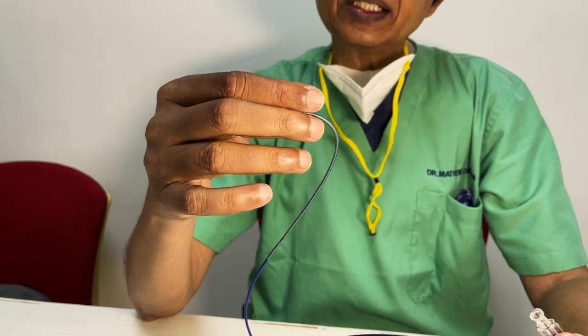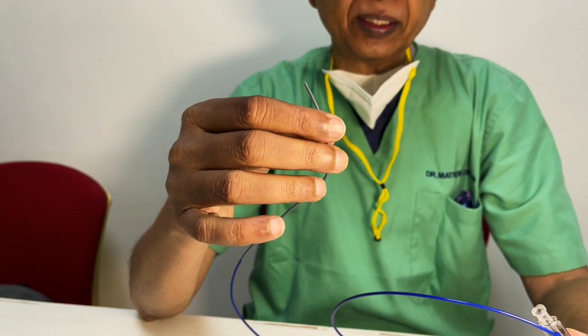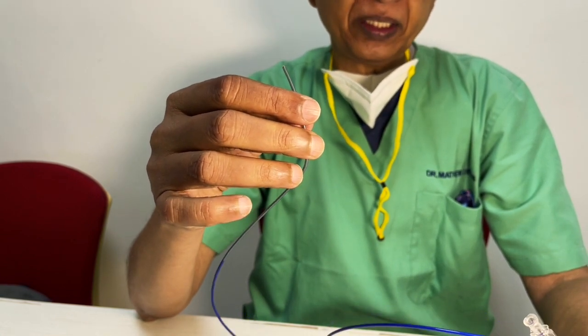Also inside this, the inner sleeve is PTFE, whereas in all the other companies, all the companies use PTFE, except the React 71, which uses a thermoplastic material, right?